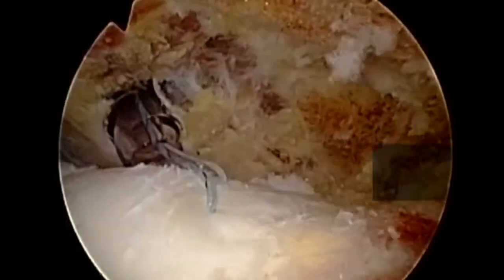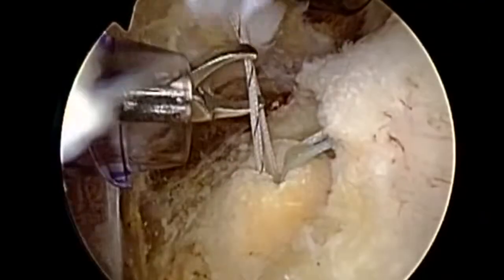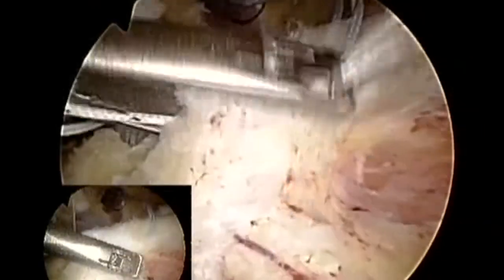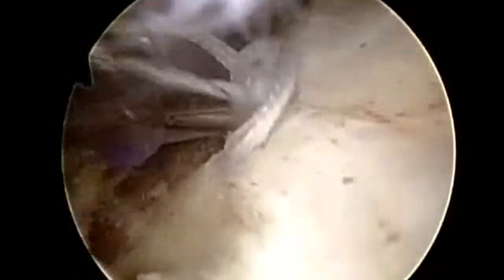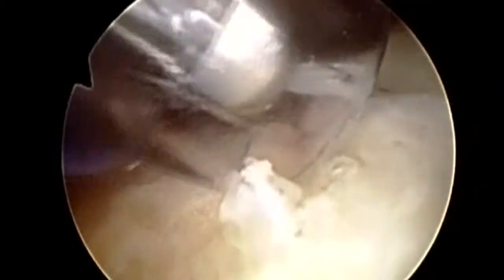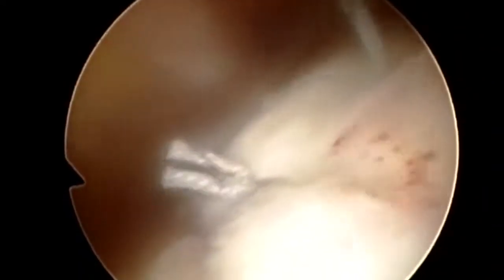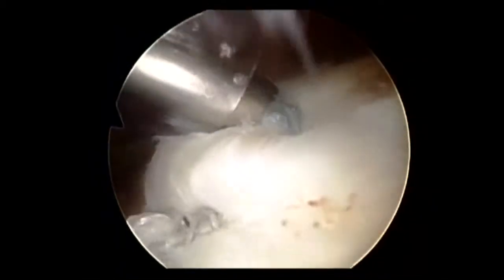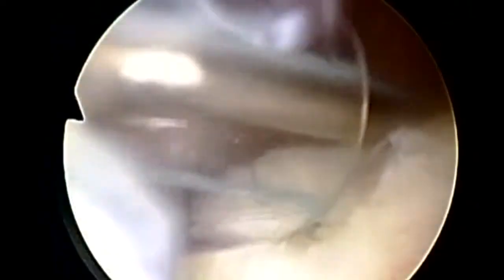This will be relayed out the front as well, and then we will relay the first limb of our second suture, and then similarly use the Scorpion fast pass to take a healthy bite of tissue. We then tie arthroscopic sliding locking knots, working from posterior to anterior, and then tying our second arthroscopic sliding locking knot to complete our repair.